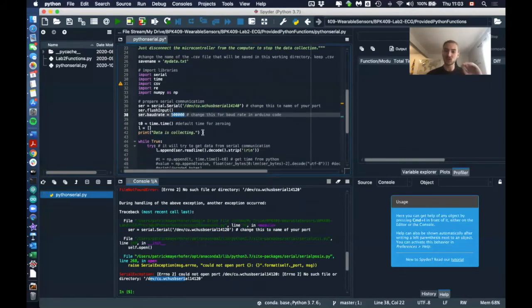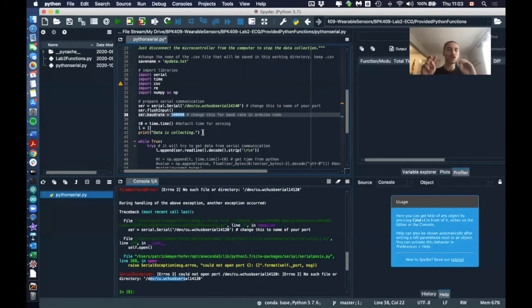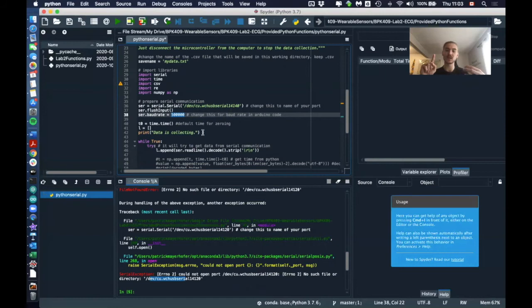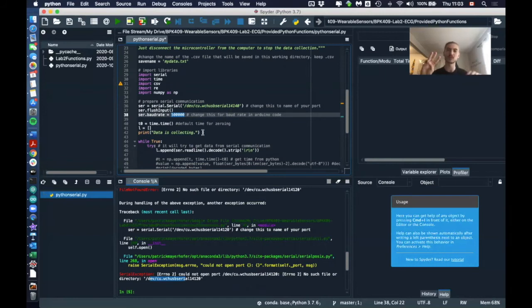And then also, this code is specifically to collect two columns of data, so we can use this for any code, it doesn't matter, but it has to be for two columns of data. If you just have one column—so maybe let's say just the electrical activity of your heart and not the time—it will not work. And also if you have three columns, it will also not work. So this is specifically for two columns.